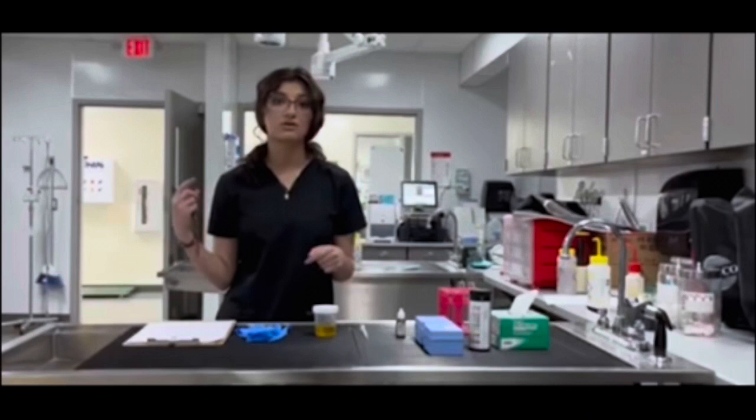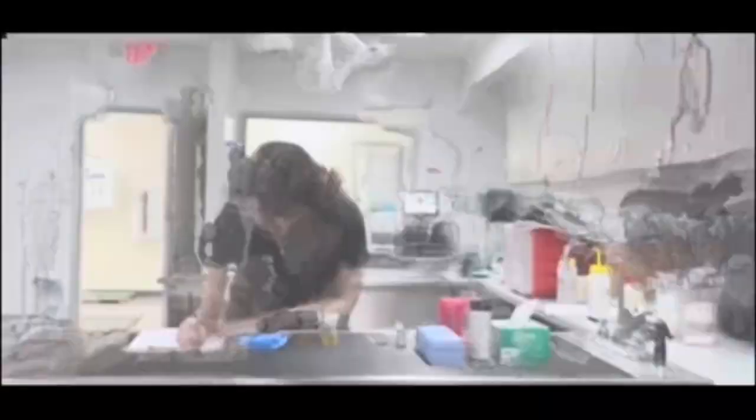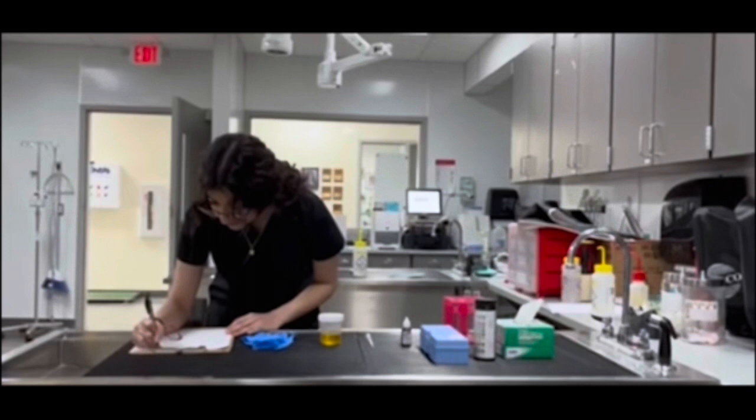So this urine sample I had gotten from one of our animals here, so you want to go ahead and put all that information on here. The collection method I used was a free catch. The date for me is the 24th, and the time of collection I had collected at 11 a.m., and my initials.